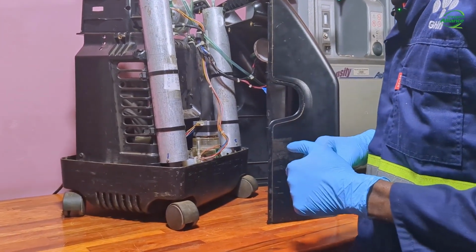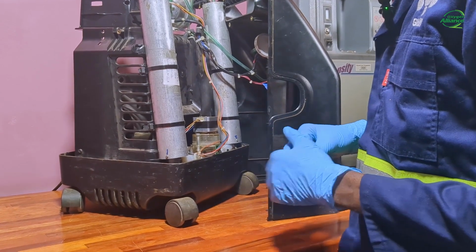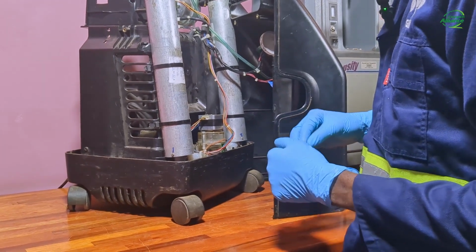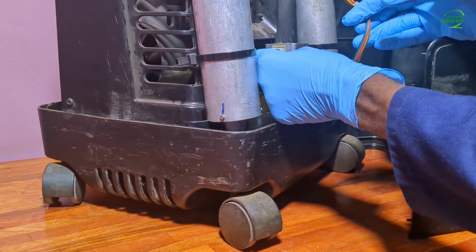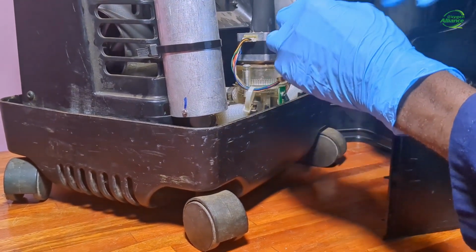Different problems can cause the valve to stop rotating. The first thing that you have to do is to inspect the wire connections within the unit. In this case, I will inspect all the wire connections that come from the valve to the control board. I will check if this wire harness is connected properly to the rotary valve. As you can see, this one is fixed.